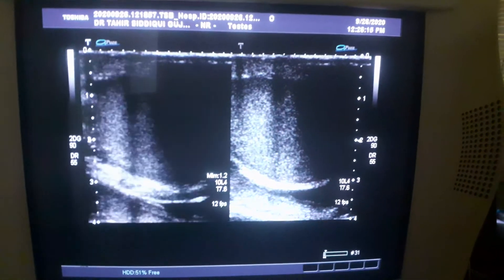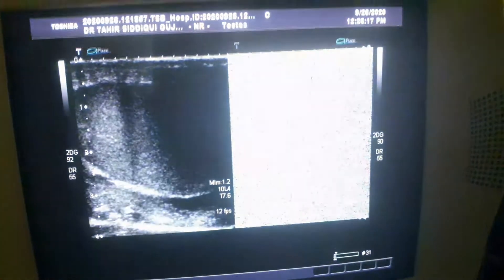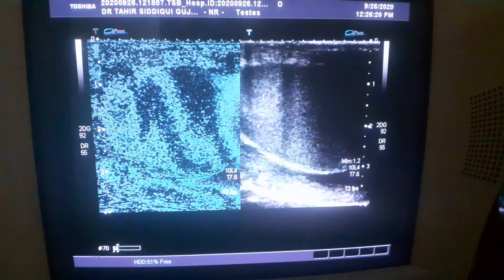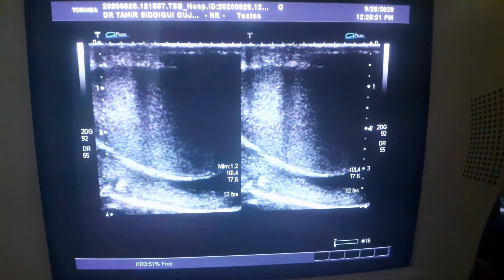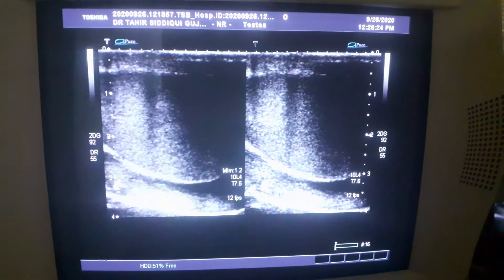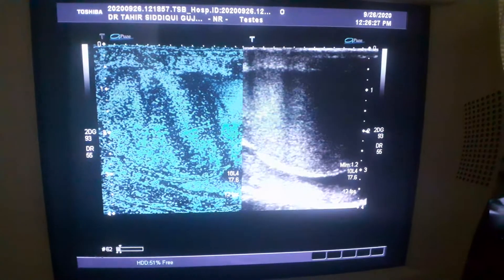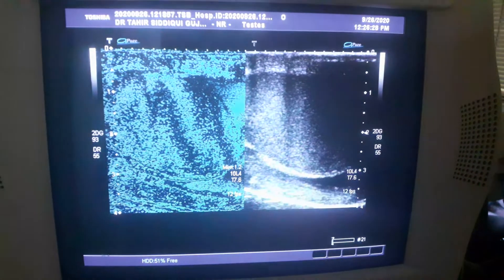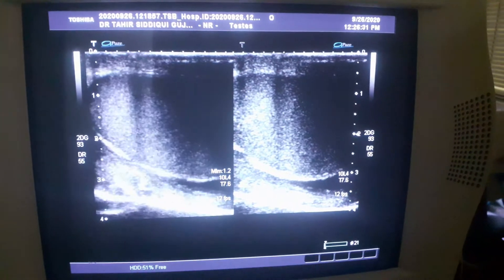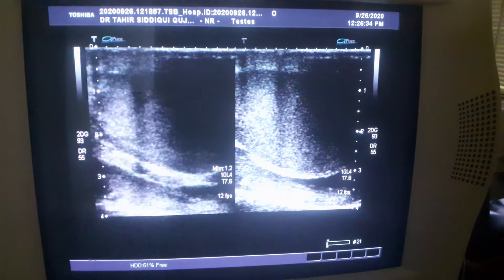This is the ultrasound of a 40-year-old young man with no history of trauma, fever, or any other constitutional symptoms. He is a laborer.